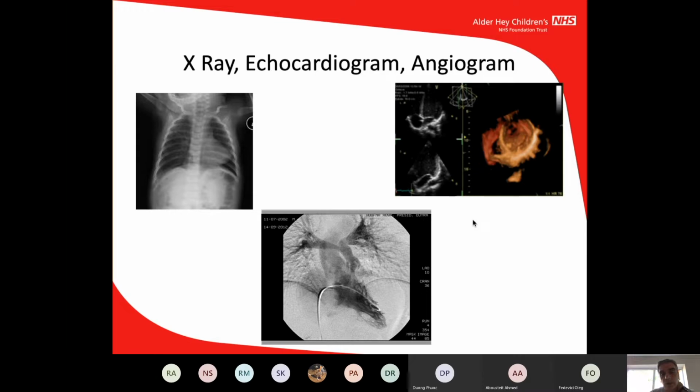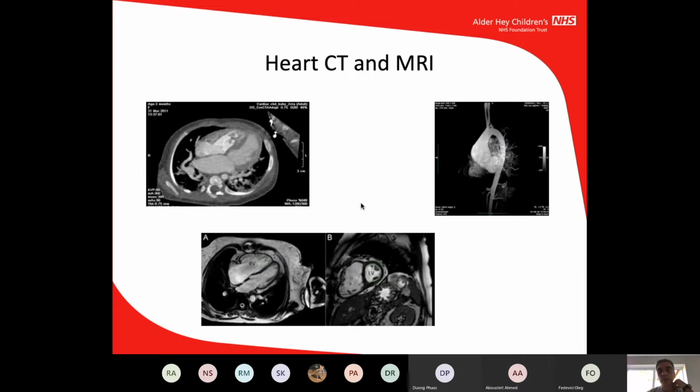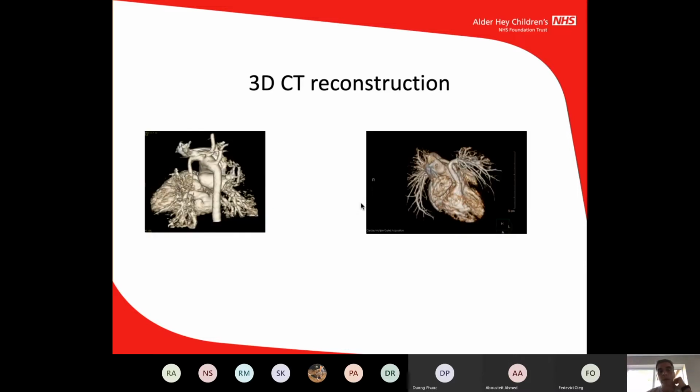And as a surgeon or interventionist, if we look into this area, I'm trying to point here, you don't know if this band is going anterior, posterior, lateral, 10 degrees in one way or 20 degrees in the other way, so it takes a lot of imagination to work out in which direction it's going. Obviously that improved with CT and MRI to give us a better view, and then reconstruction, which tells you the aorta and the arch are in this way, and the pulmonary artery is going one anterior, one posterior. But again, it doesn't give you an exact direction, 10 degrees or 20 degrees. And when you are with the heart stopped, or in the cath lab, trying to put dye and dye and dye to find out which direction, it's not perfect.